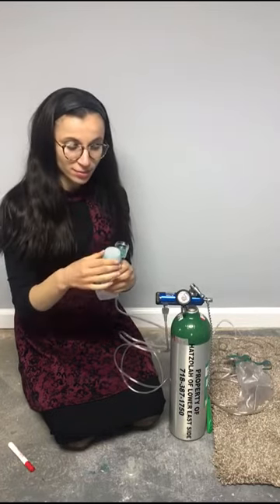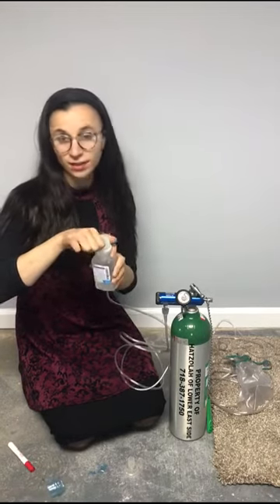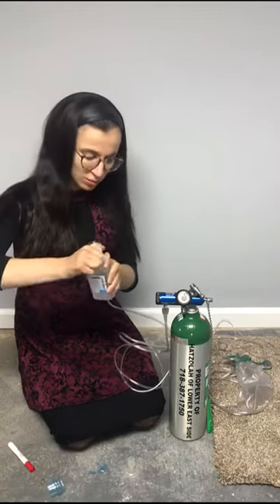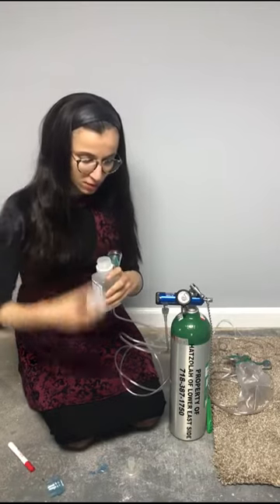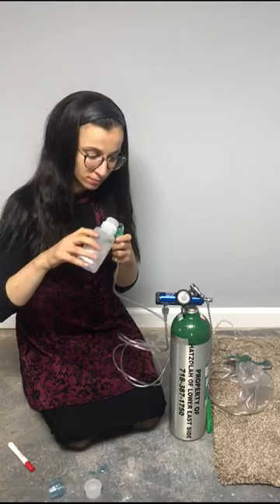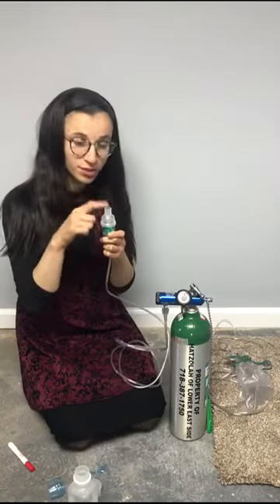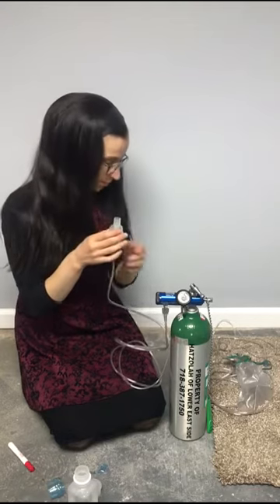This is called a nebulizer. So let's say this was albuterol. It's not, it's saline. You could also put saline in. You're going to open it. You're going to pour your saline or albuterol in it. You're going to close it. And you're going to attach this to the device.